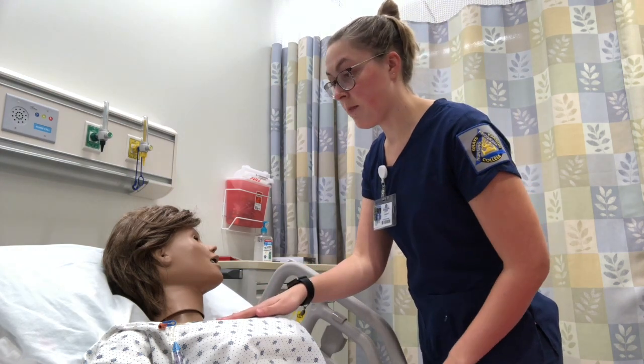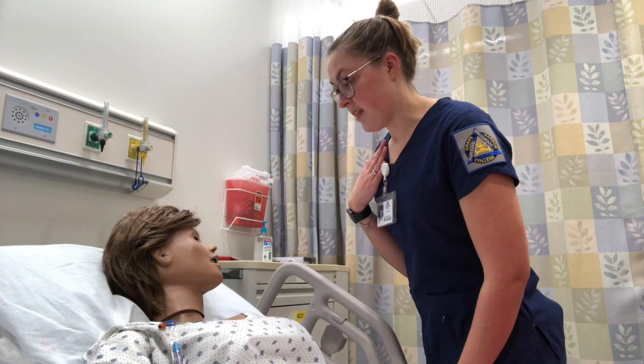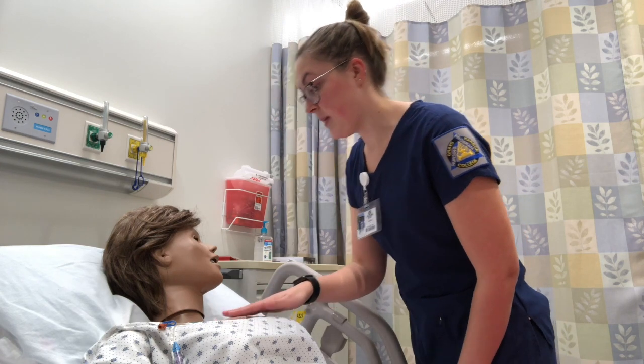Before we begin, I'm just going to assess your central line site for any signs of infiltration. Signs of that would include inflammation, blanching or coolness of the skin surrounding, and a wet dressing, which does not appear to be any of those.